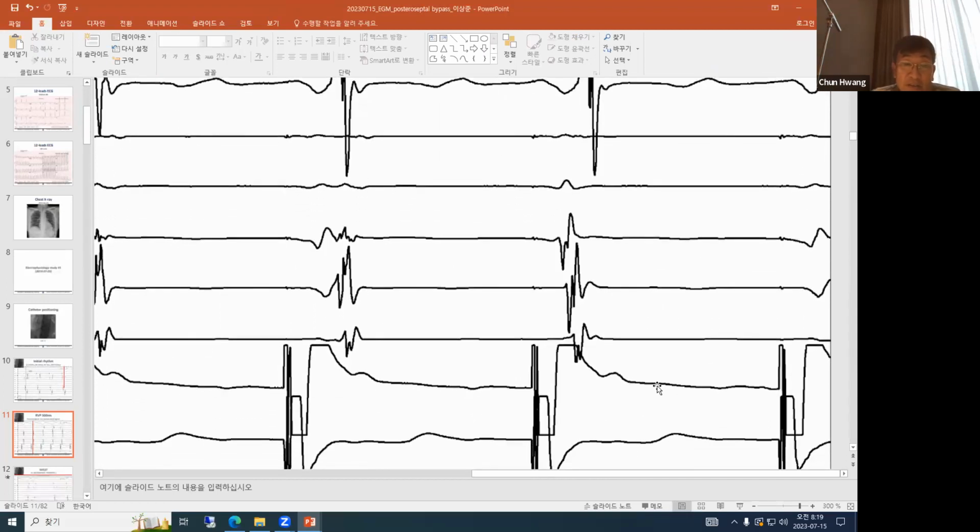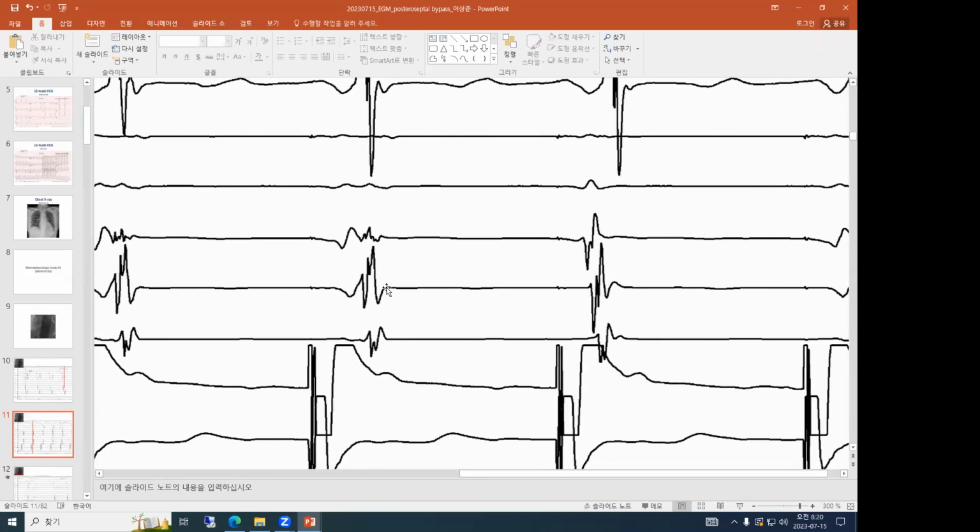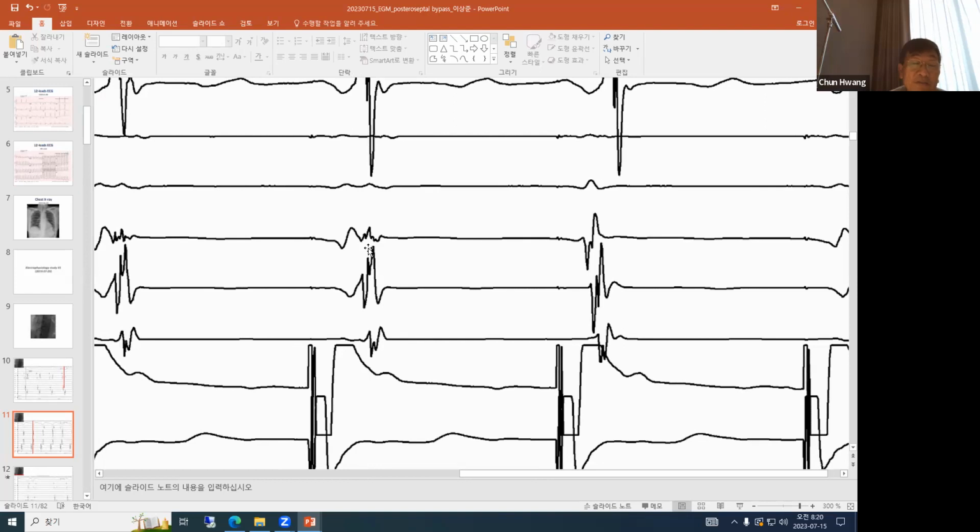Okay, good. Let's focus on 5, 6. Now look carefully at 5, 6 and be sure to look at it together with the previous beat. That's on the screen. You see, yeah, that's the one. Go to B. Start from B. 5, 6. Yes, 5, 6. Not there. Coronary sinus. Coronary sinus EGM. Yes. Start tracing B. B right there. Come back slowly. Follow the V. Very slow. Yes, go a little further.